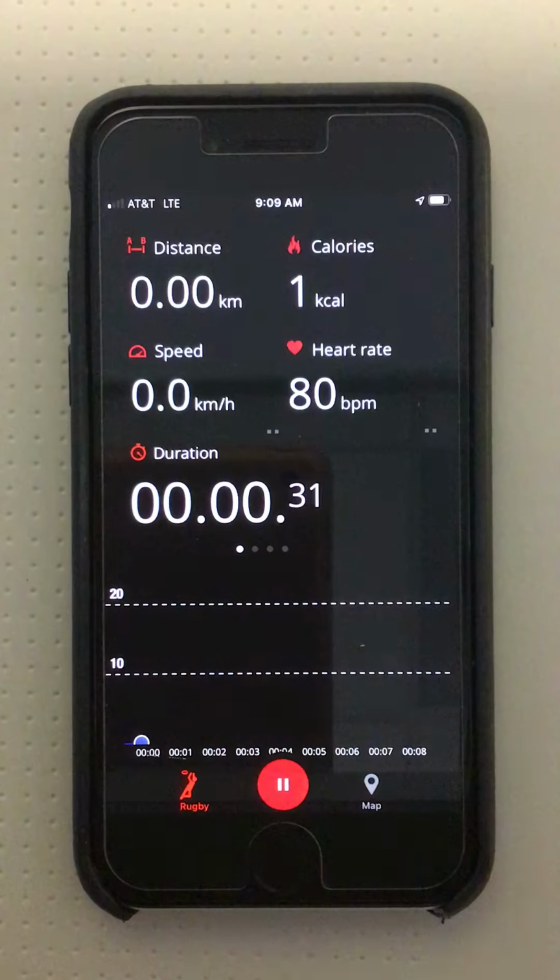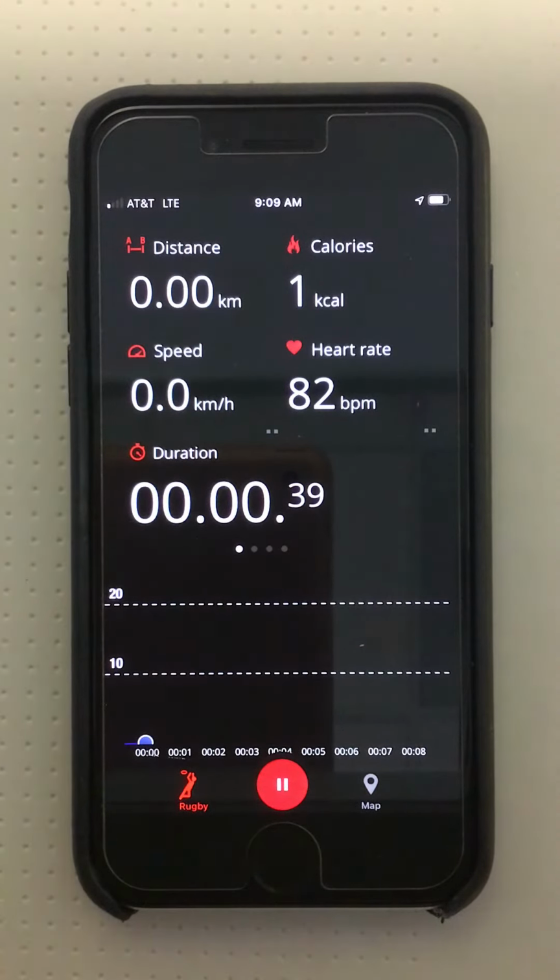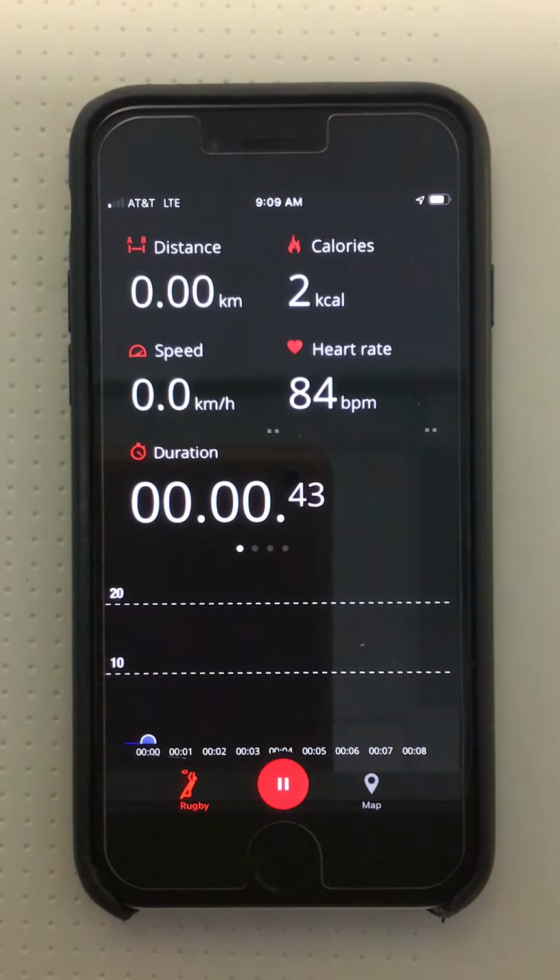You are burning fat. The heart rate text will be white when the patient's heart rate is less than 60% of heart rate max. So clearly, that's where I'm at right now at 82. It will transition to a blue color once the patient reaches the 60% heart rate max zone. At 70% of heart rate max, the text will transition to a green color.